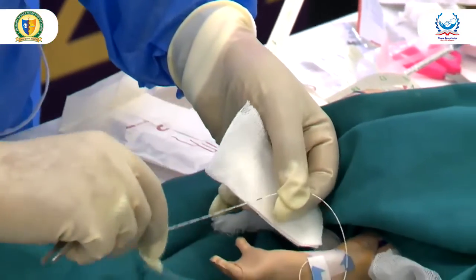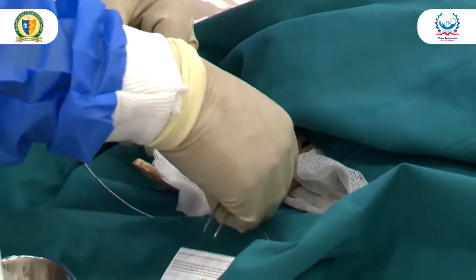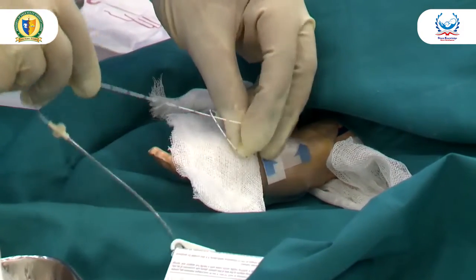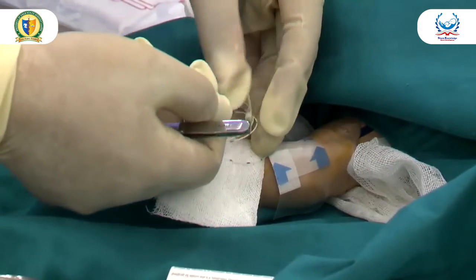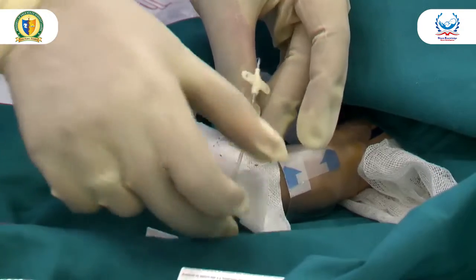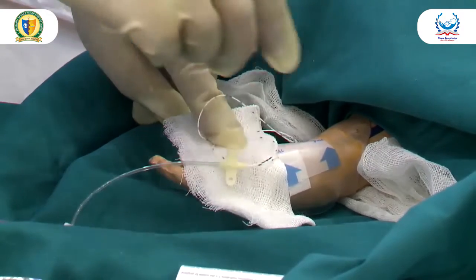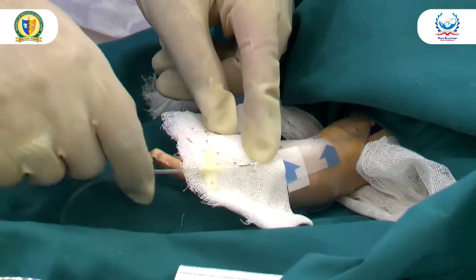Let's say the line is here in the subclavian region. It's not at the junction of the atrium and superior vena cava, or the inferior vena cava and the atrium. What will you do? Anybody? Yes, ma'am. Go ahead. Always insert 1 to 2 centimeter more so that we do not have to push it. We cannot push the line, but we can pull it out of the vein. Why do you pull it out?